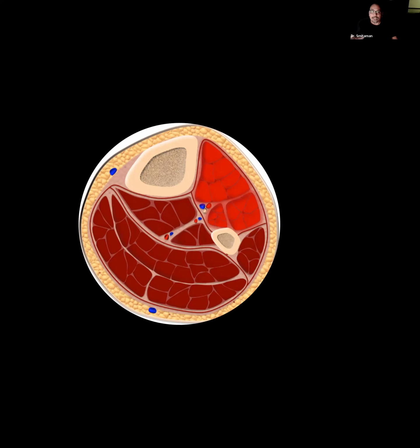syndrome typically going to be more asymmetric and often focal, okay? You mix in some architectural distortion of the tissues. You can look for intramuscular fluid collections. Intramuscular edema can also be helpful and target what you're looking at, okay? But as important, MR, okay, is helpful for localizing active disease, the most affected muscle, if anything. And that obviously we can subsequently target with ultrasound or perhaps sometimes CT guidance if you want to make sure you're at the right level.